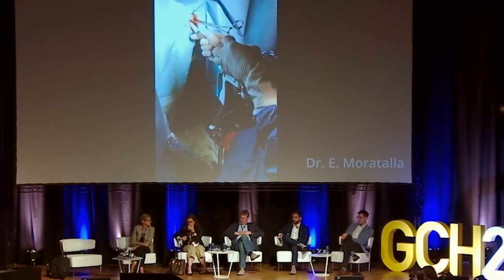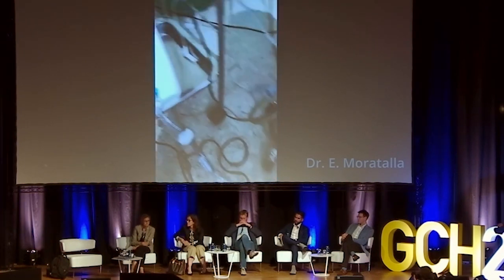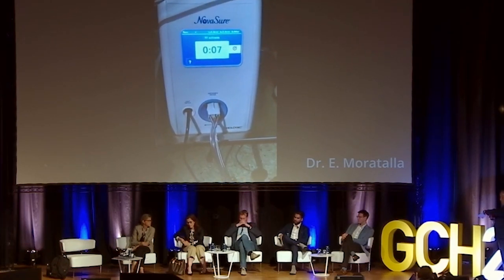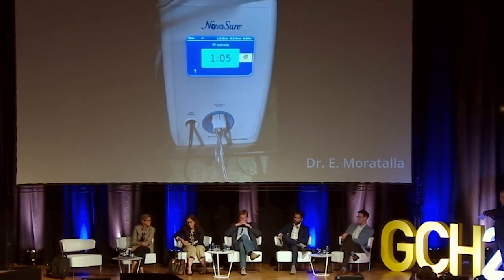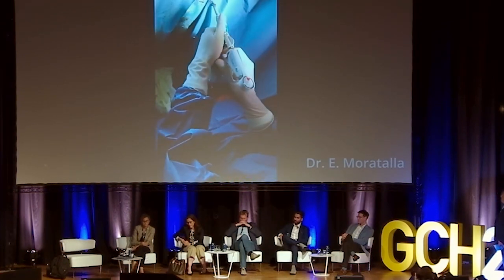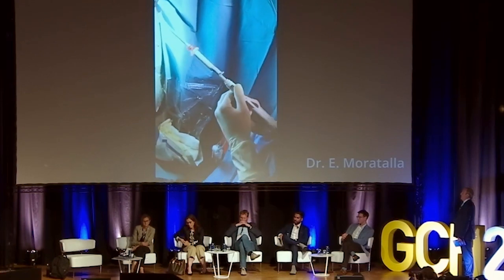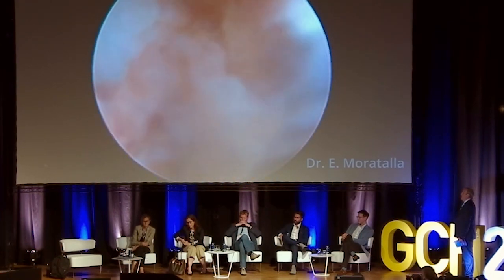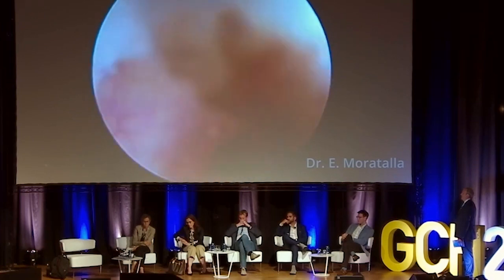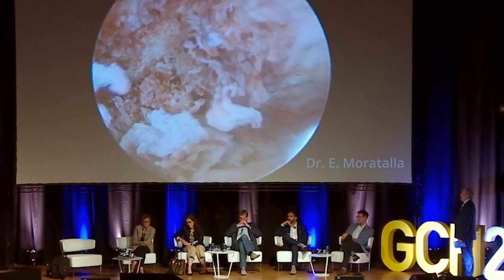Hold the tenaculum, advance to the fundus, and slide the cervical collar. After inputting the data, we press the foot pedal and the endometrial ablation begins. In this specific case, the procedure lasted for 1 minute and 7 seconds. Subsequently, we remove the NovaSure device and we perform a hysteroscopy to confirm the successful endometrial ablation. During the procedure, we observed that the previously present endometrium is completely necrotic due to the radiofrequency endometrial ablation.